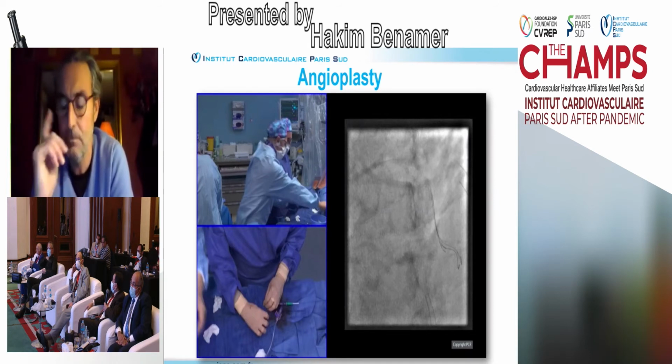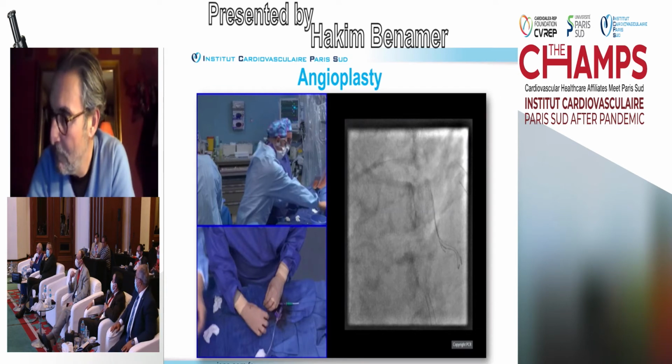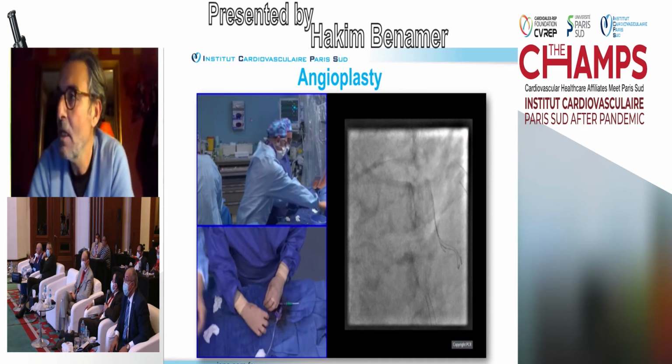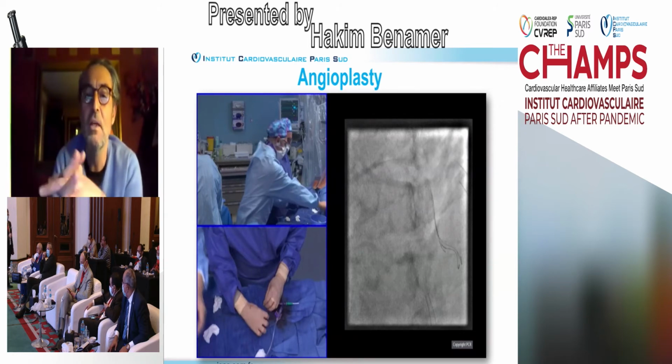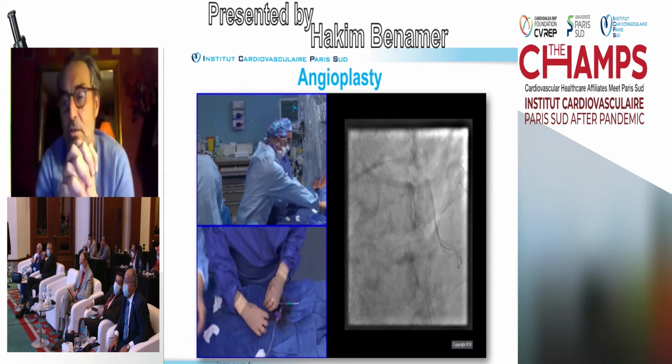Okay. It doesn't mean that if you manipulated for a few seconds or 1 minute, this is ostial involvement of the branch. It does not reflect a tight lesion. Do you agree with that? Yeah, absolutely. It's not reflecting a tight lesion. It's regarding the architecture of the stent regarding the ostium. So sometimes you have to work a little bit to cross.